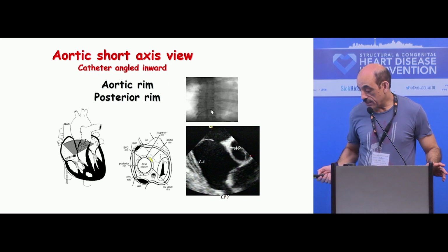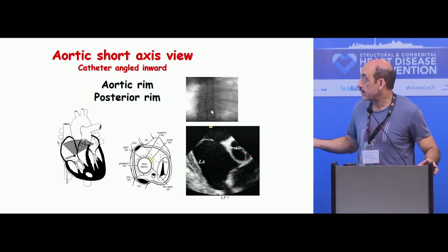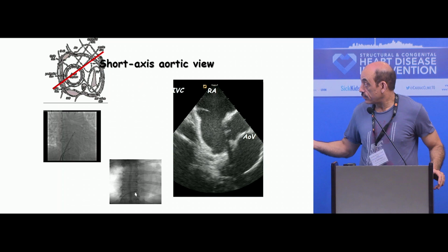Okay? Short axis view, as I was saying, you can do it with the right-left knob or rotate the whole catheter medially. So you look into the barrel. Essentially, the aorta is here, and you will see a beautiful short axis view. Really, really easy to do if you conceptualize it. Quickly going through, this is a short axis view, real life.